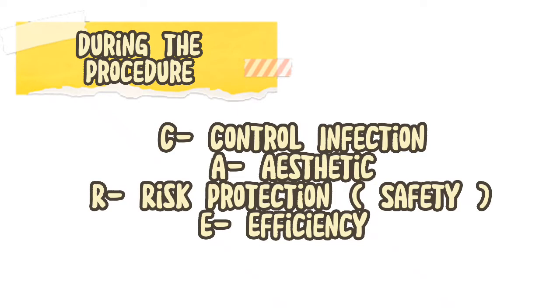During the procedure, remember the acronym CARE. C. Control infection. Wash hands before touching the client. A. Aesthetic. Maintain correct body mechanics. Perform procedure with acceptable style and art.